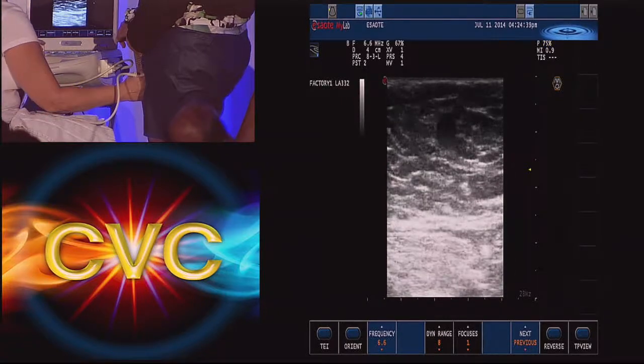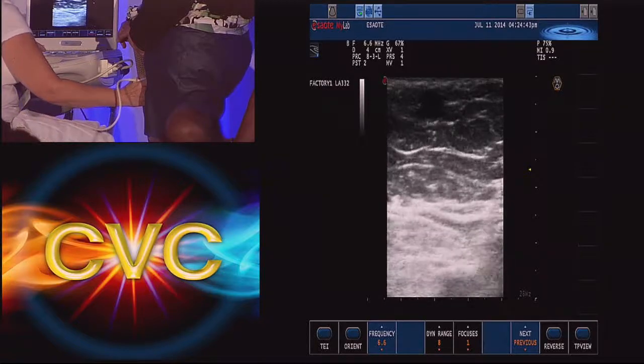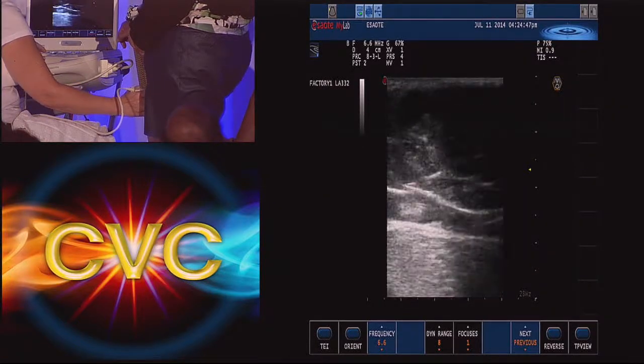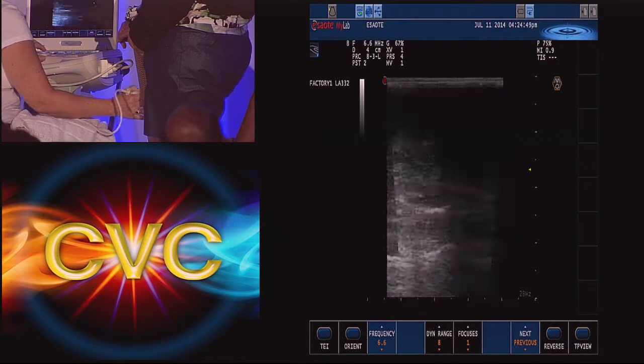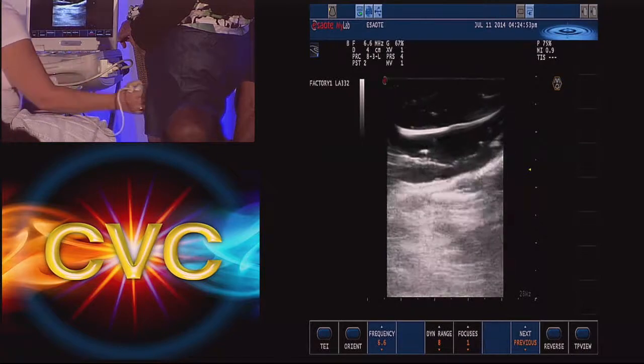So we actually have a matrix. We create a spreadsheet where the saphenous at the saphenofemoral junction, mid thigh, at the knee, below, and we keep going down. All the perforators, lesser saphenous, the same. We measure how many seconds and whether there's reflux or no reflux.